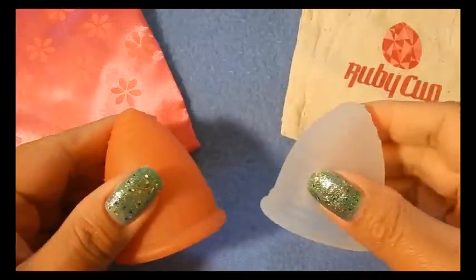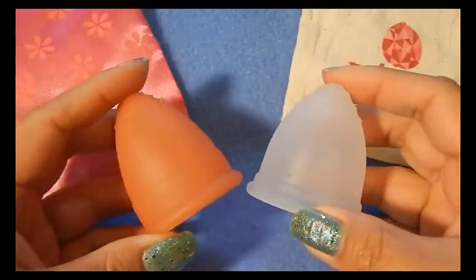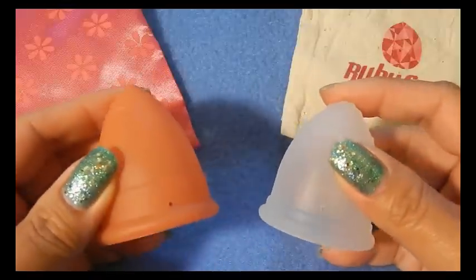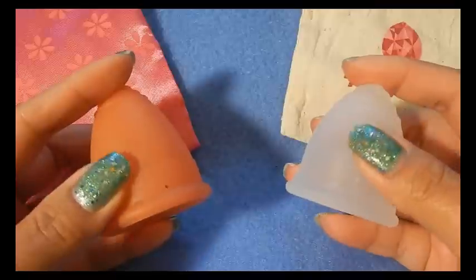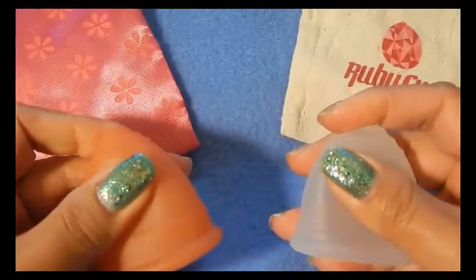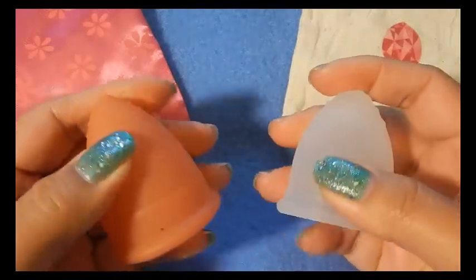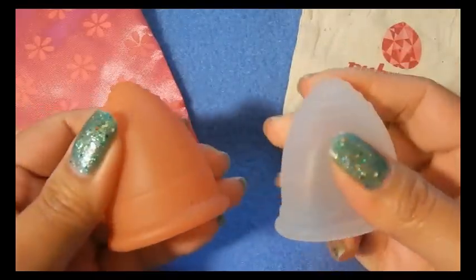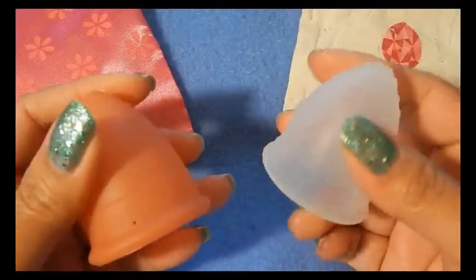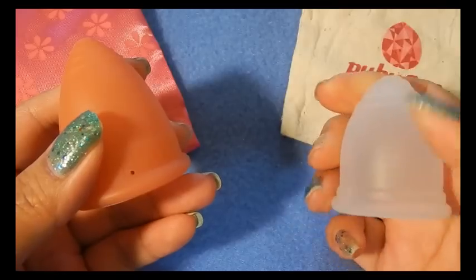Both of their websites — the Lunette website and the Ruby cup website — do state that they use medical grade silicone. I did not check for certificates, so if you are worried about that or curious about that, you'll have to check those on your own. The silicones feel very similar to the touch, and the texture of them feels very similar to each other. The Lunette is from Finland and the Ruby cup originally started in Germany and they have bases in Berlin and Kenya now.